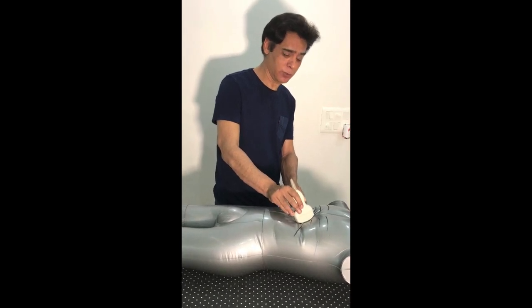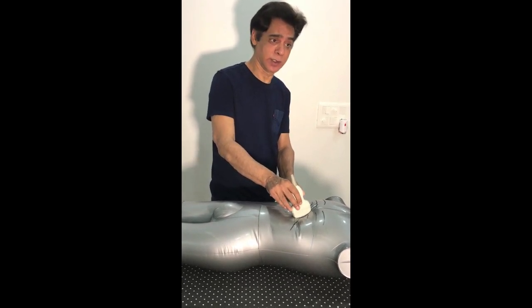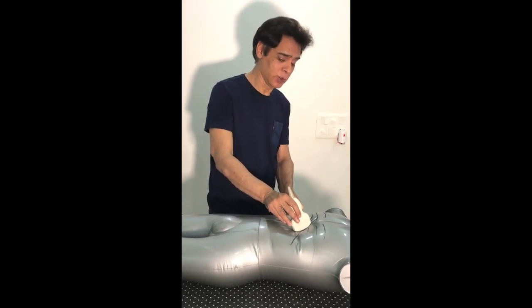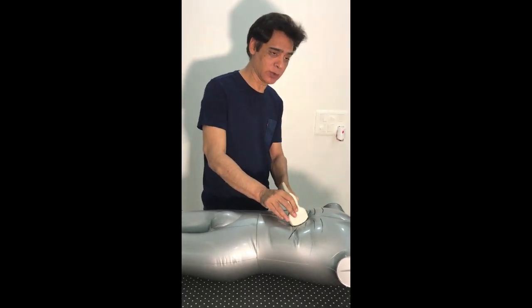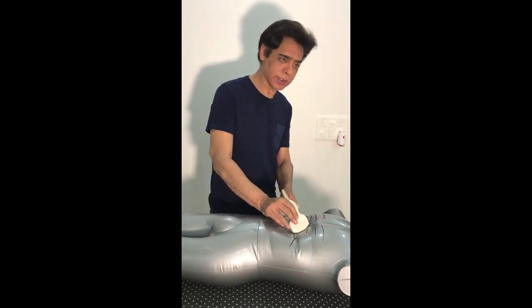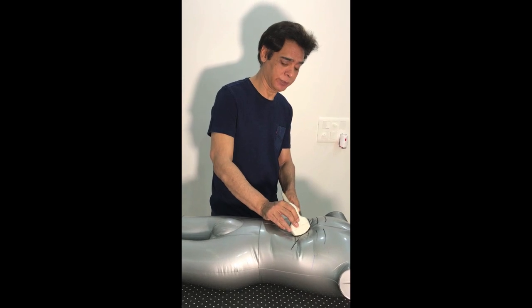Now if you see the probe movement, I can show you here that I am moving it like this, but so much movement is not required. If you move this much very fast, the area of interest will go away. In order to show you that the movement has to be this way, I am just exaggerating it a little bit. Otherwise, the movement has to be so subtle that most of the time only the person doing it can make out that the movement is there.